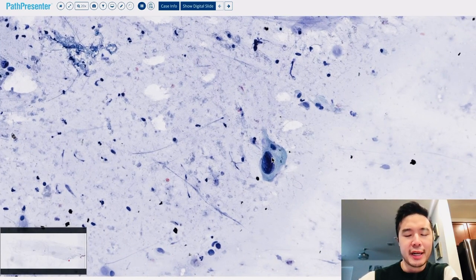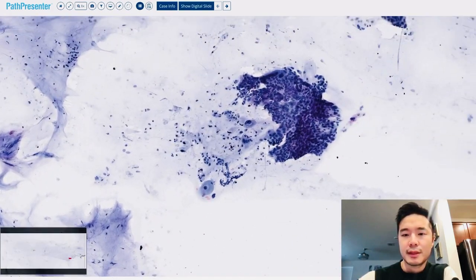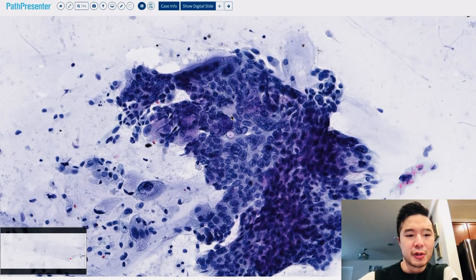But you can just appreciate how atypical some of these cells are. If this is your lymphocyte here, you can put maybe even more than 10 in this nuclei, this bizarre nuclei. Here you can appreciate better some of the drunken honeycomb and some of the PTC-like nuclear features. It has nuclear grooves, which is akin to the grooves you see in coffee beans. It has that eccentric nucleoli. It's got a lumen, so it's an adenocarcinoma, and it's got that 4-to-1 anisonucleosis.